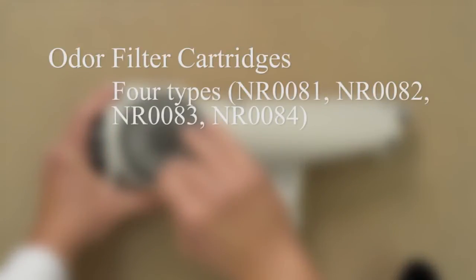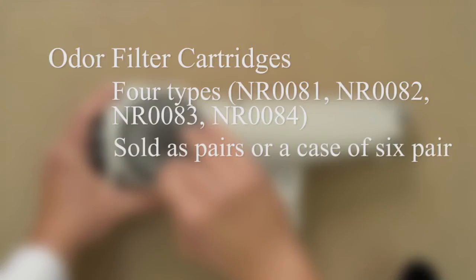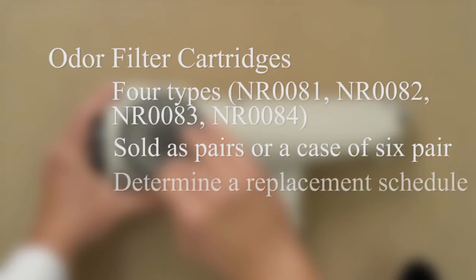The useful life of the cartridges will depend on how often they're used and the strength of the odors they're filtering. A reasonable rule of thumb is to change the cartridge after 200 hours of field monitoring. Measurement of high odors may require a more frequent change schedule.